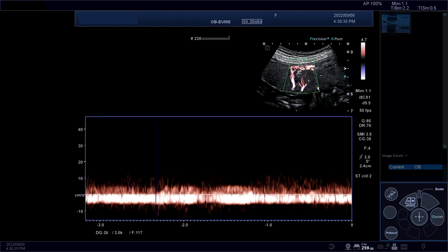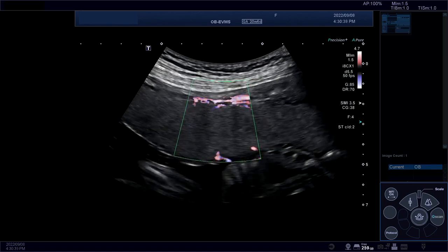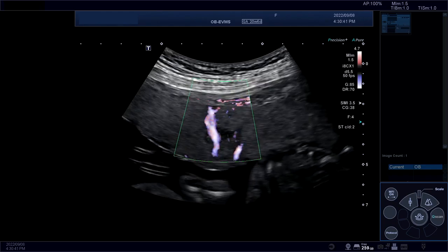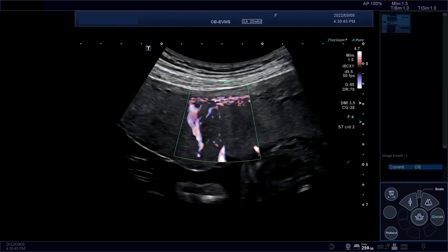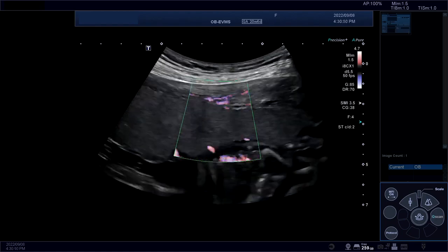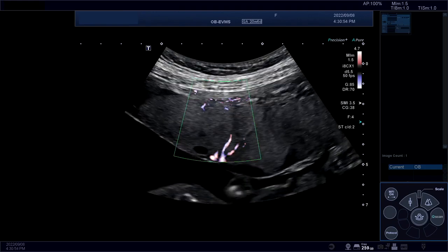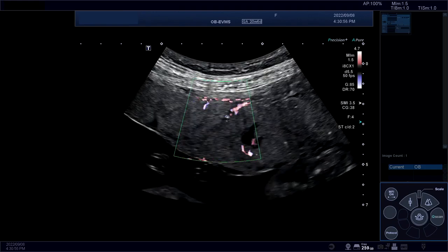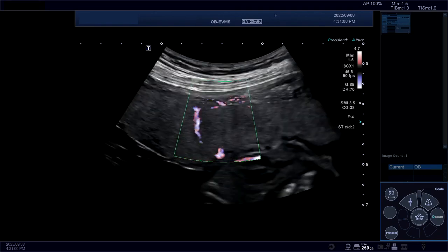And typically by 22 to 24 weeks, they will have almost the same features as venous flow if they've gone through the full adaptation. And that's really helpful to assess the spiral arterial flow and the fetal placental arterioles and how they change in pregnancy. And we've been doing this for 6 years, so we have a huge amount of data related to placental adaptation and markers of placental disease and so forth.